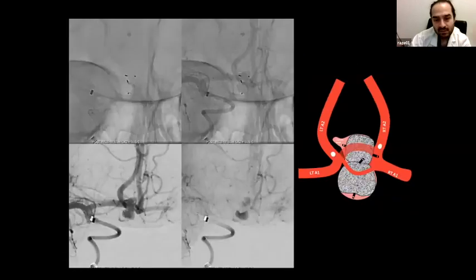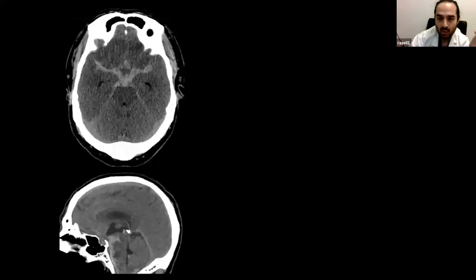So how to treat? This kind of imaging told us that we can actually put two webs, stack one on top of each other, and that's what we did with a very good result. But bottom line is that this is an example where the cone beam CT imaging led to a better understanding anatomically of what we exactly were dealing with.